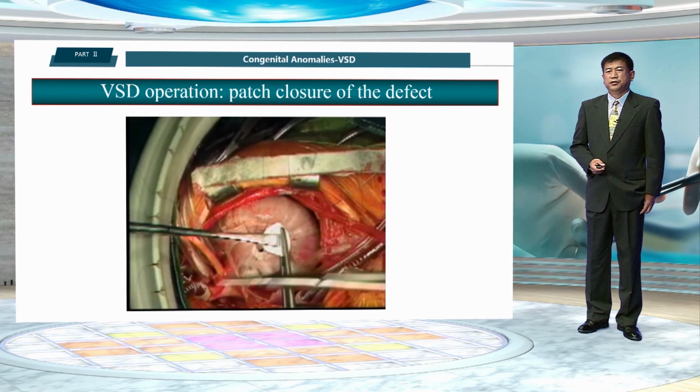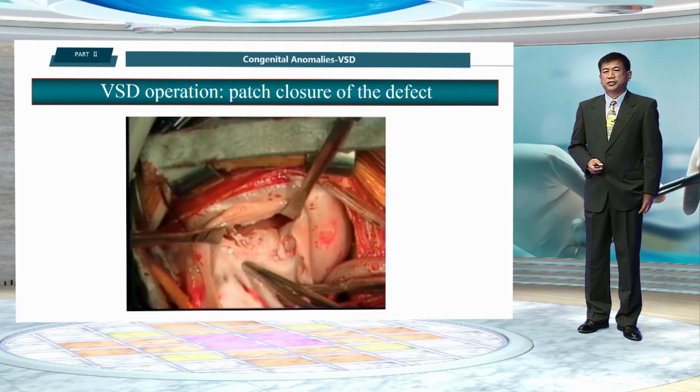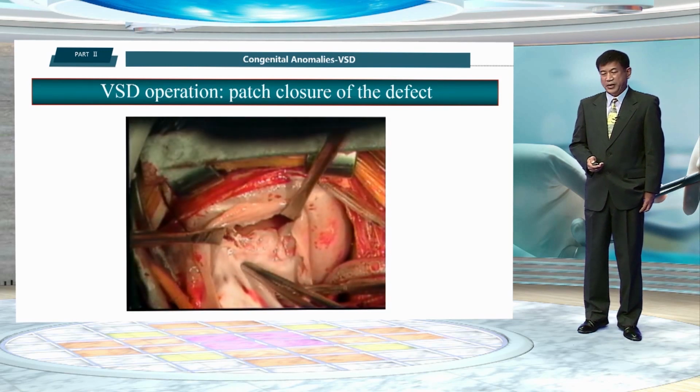And now, the sutures are passing through the patch.